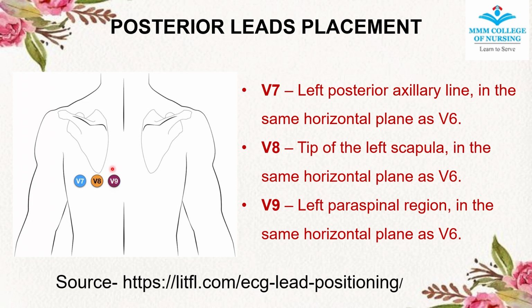Here, the posterior lead recording is a crucial diagnostic investigation in case of a posterior myocardial infarction. We often ask for this posterior lead recording in case of inferior wall myocardial infarction, because the right coronary artery, which supplies the inferior wall, is the same artery that also supplies the posterior wall. So, whenever there is an inferior wall MI, it becomes mandatory for us to rule out posterior wall myocardial infarction.